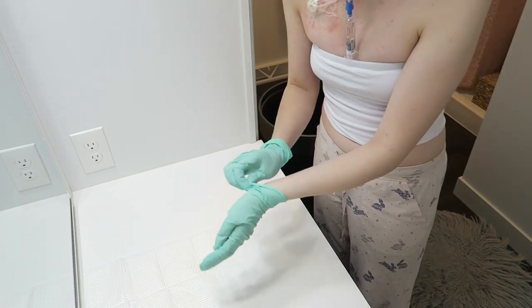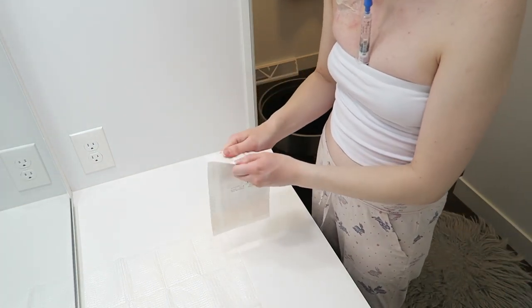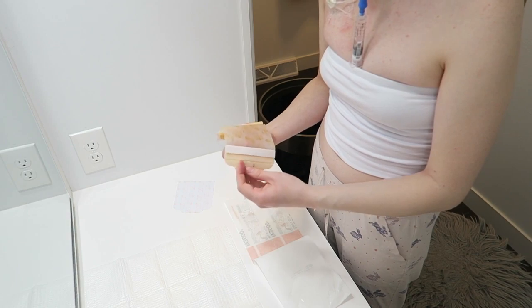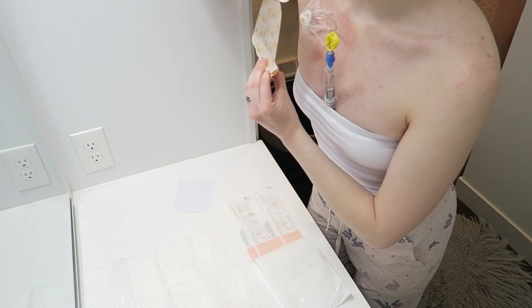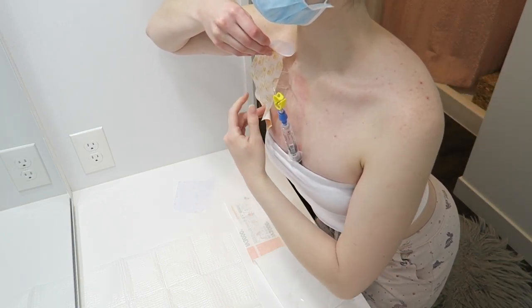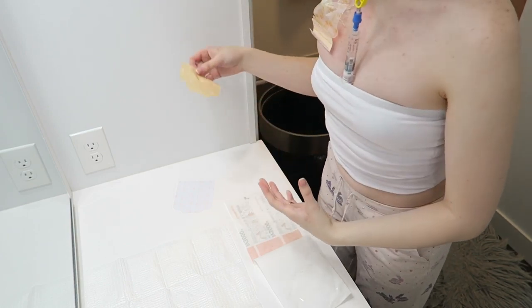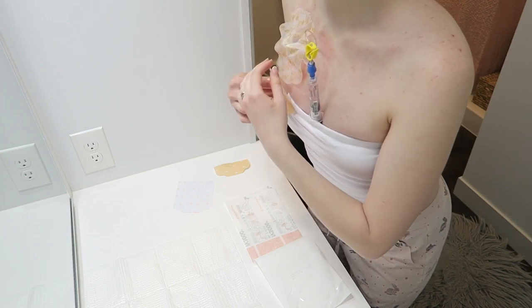But I no longer need my sterile gloves because this is not sterile, so no longer needs to be sterile. So we're gonna take our other dressing and we are going to open it. And I do not put these on the proper way. There's like a three-step system and I don't like doing it that way. So now I'm gonna go ahead and find the middle here, put it on, push it lightly down. You don't ever wanna push the dressing on super firmly. That's gonna push the port or put a lot of pressure on the needle to push into your port, and it's very uncomfortable.